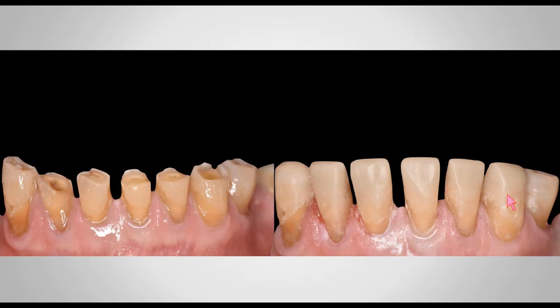Now, when you become very proficient with this technique, you can do all anterior teeth at the same time in one sitting, like I will show you how to do it with the flowable composite. So again, a very easy technique. The sensitivity of the technique has a lot more to do with the actual preparation of all the guides and everything. That's what I'm going to show you soon.